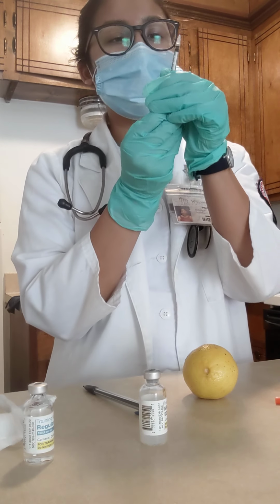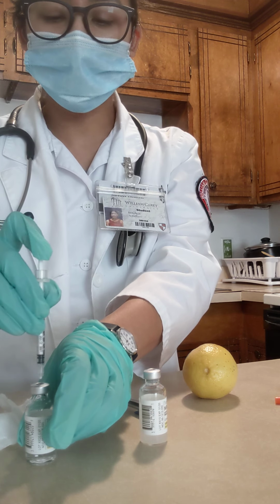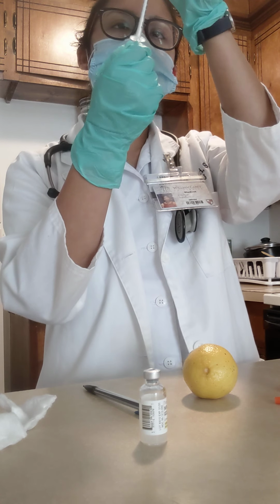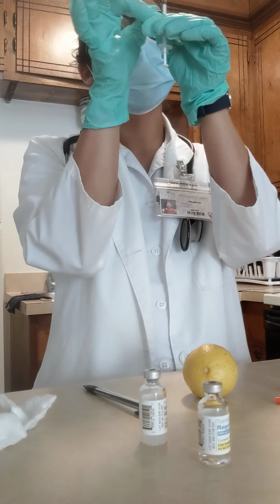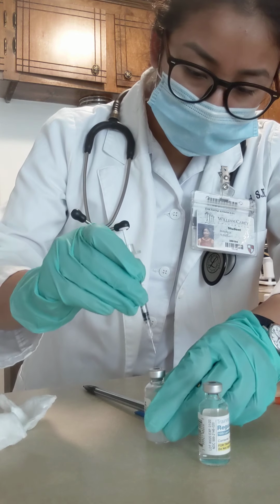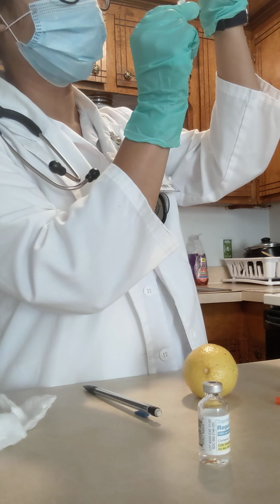Now I'm going to aspirate 6 units of air and inject it inside the regular insulin vial without touching the top of the solution. Now I'm going to draw 6 units of regular insulin. I'll make sure I have the correct dose and get rid of the air bubbles. Now I'll aspirate 16 units of NPH insulin, and the total inside of this syringe should be 22.